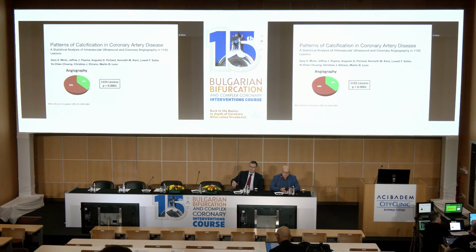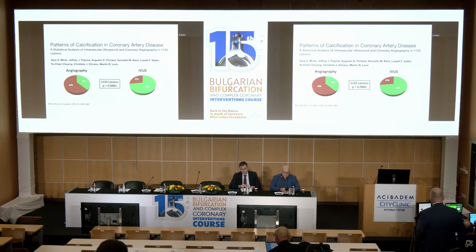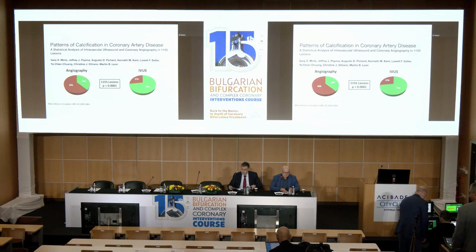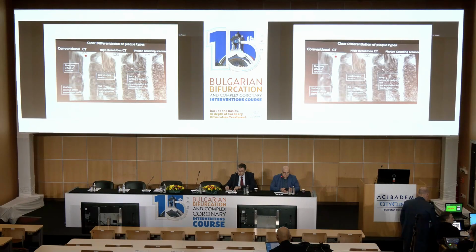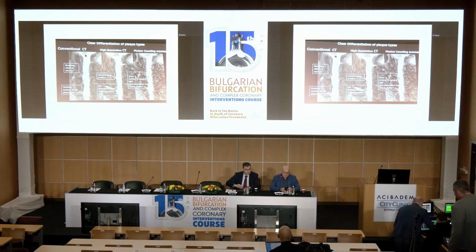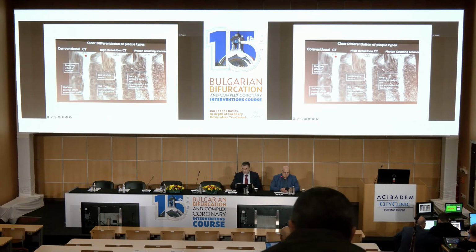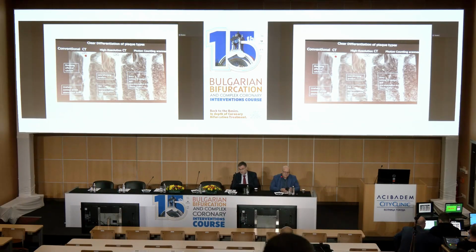If we just take a look by angiography, we definitely under-recognize the calcium, which can be seen in imaging with IVUS and nowadays OCT. And this is a picture from Dr. Collet. So nowadays, we even have the option to take a look pre-angio with photon-counting CT, and you see the resolution here with photon-counting CT is excellent, comparable with IVUS. So you can then make a correct plan of the procedure ahead.